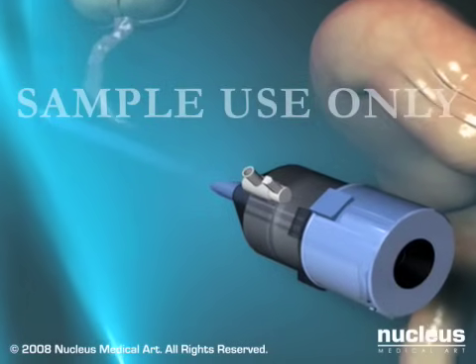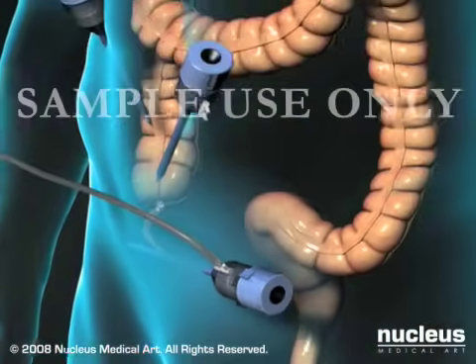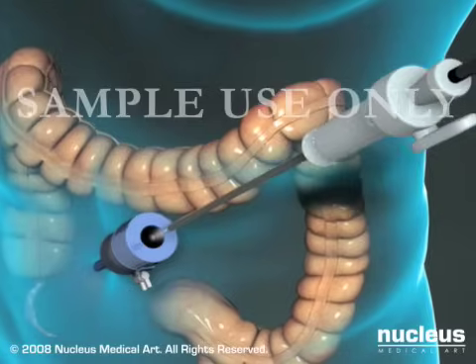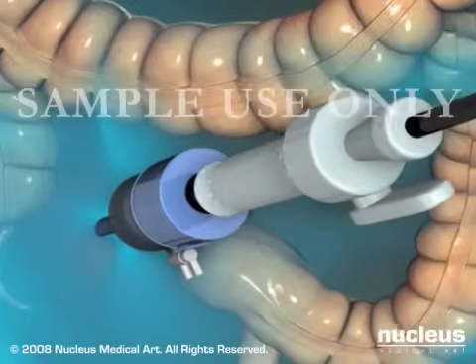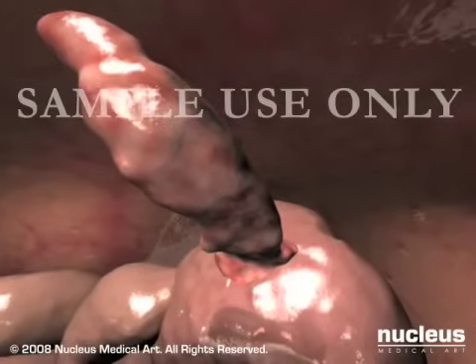Carbon dioxide gas will then be pumped through the umbilical port to puff up your abdomen so its contents can be viewed more easily. Next, your surgeon will insert the laparoscope through the umbilical port. Images from its camera are projected onto a video monitor in the operating room.